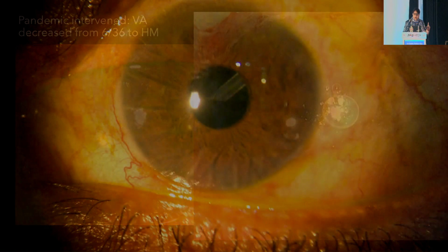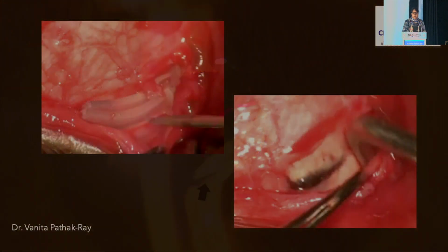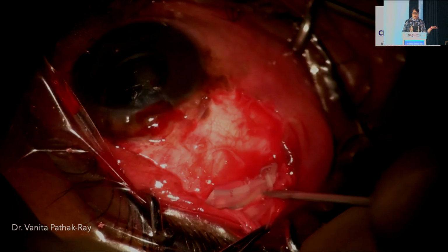So I had to use a Venflon tube. Because it was a short tube, I had to use some extra hardware. So this is a high myopic eye that underwent RK in the past, has had RD surgery, and is aphakic. So this patient had AGV, and I ligated the tube. And here, this is silicone oil. I don't know whether you can see the meniscus there, and you can see that the tube itself is patent. And the belt buckle, you can easily remove, as you see in this particular case.